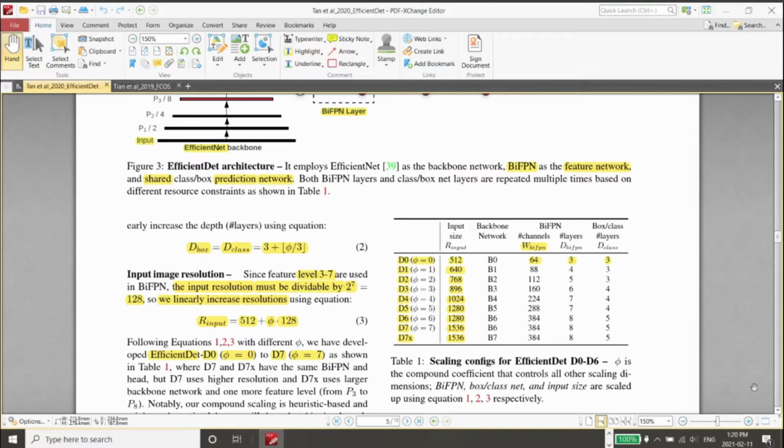Yeah, so I guess you can get good results, and this means it's just the recommended one. It doesn't mean that if I use D3 with 768, I'm not going to have a good result. But these are based on their experiments that they recommend these sizes. So cool, that's helpful.